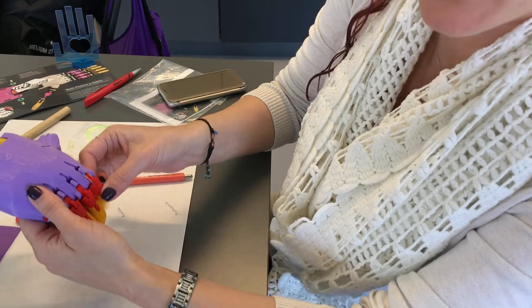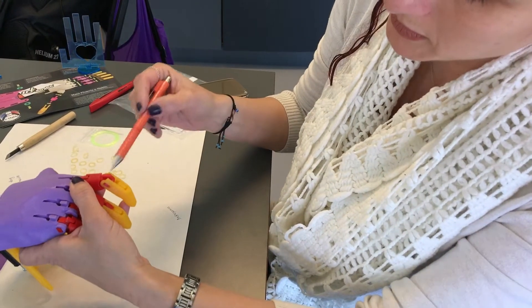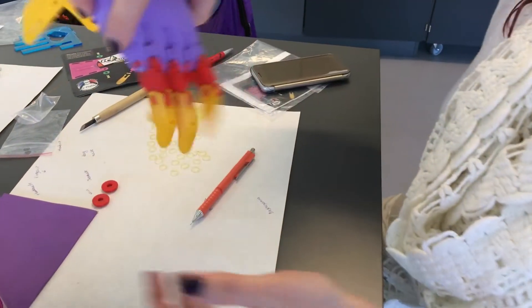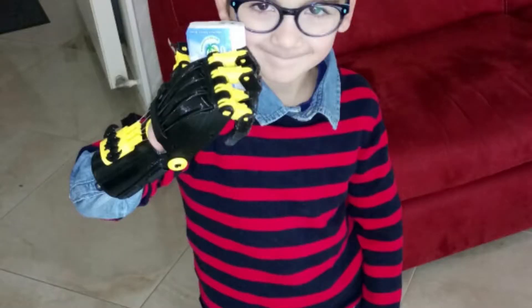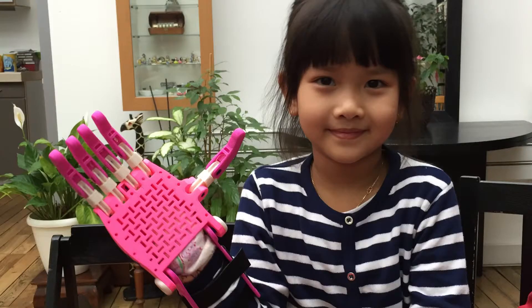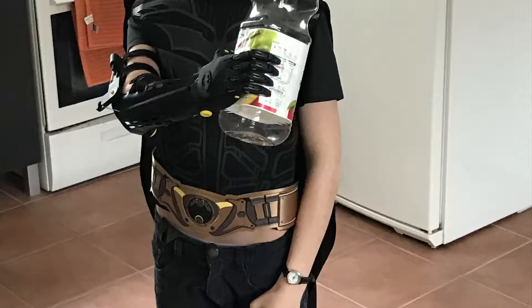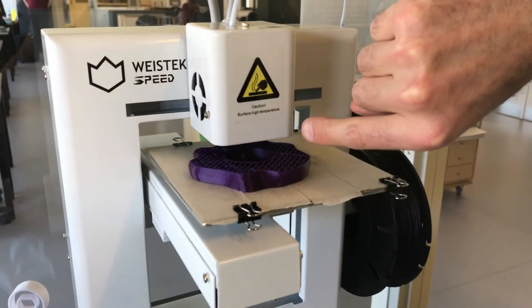These are kids born either with a wrist and palm but no fingers, or no wrist at all. There is a functional benefit — through our device we give them back the grip they are missing, which is very important just to hold objects. There is also a strong social impact: it turns them from the kid with a disability to the coolest kid on the block.